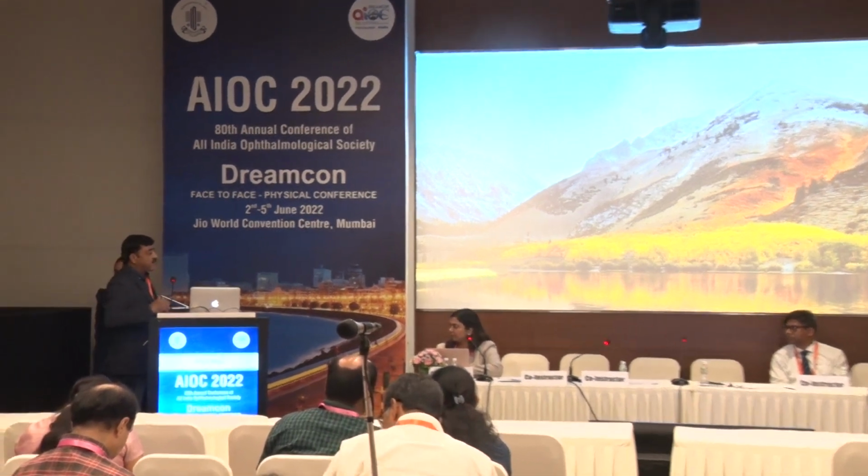What about the age of the patient? Does the correction vary with the age of the patient, the corneal rigidity? Yeah, corneal rigidity in the younger age, probably not over a period of time, because as the eye grows, astigmatism changes. But people above 65, 70 going in for a femtocataract want early rehabilitation, and maybe they would not pay that extra. Definitely this is an extra armament.